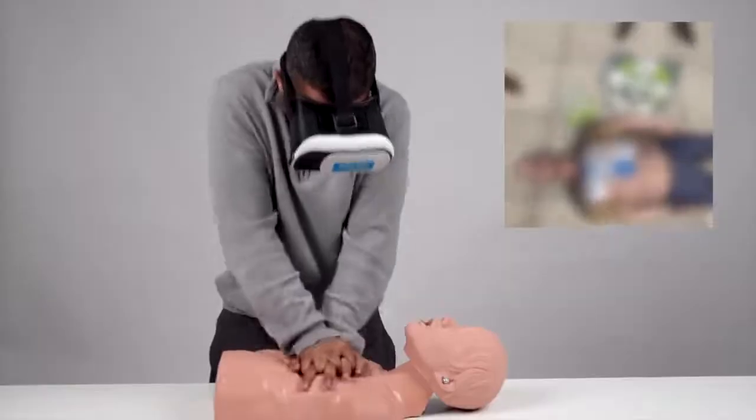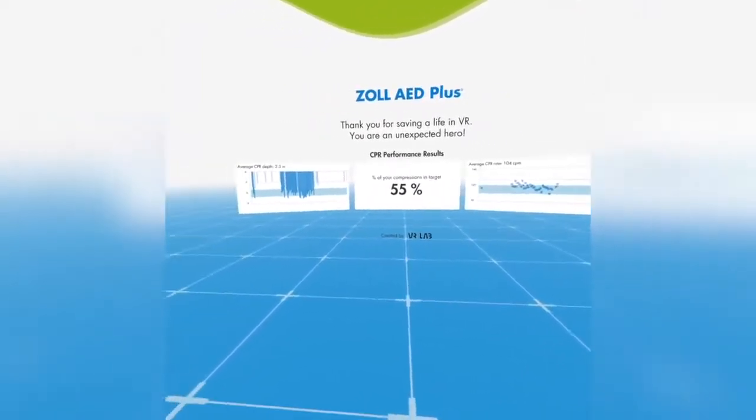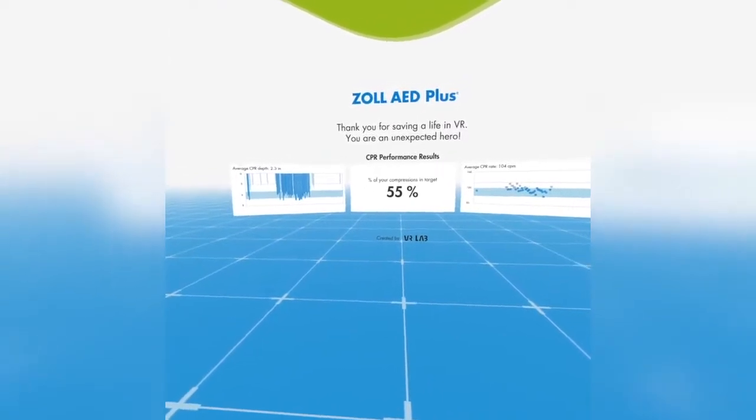Once complete, the app will score your compressions. Note that the app is intended to be a simulation of Real CPR Help and not designed to be as accurate as the actual ZOLL AED.